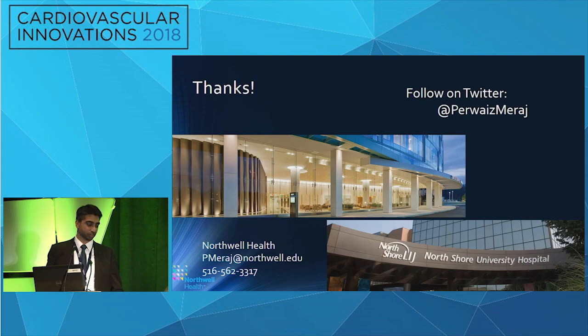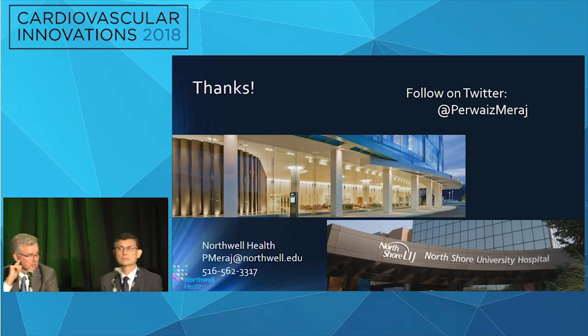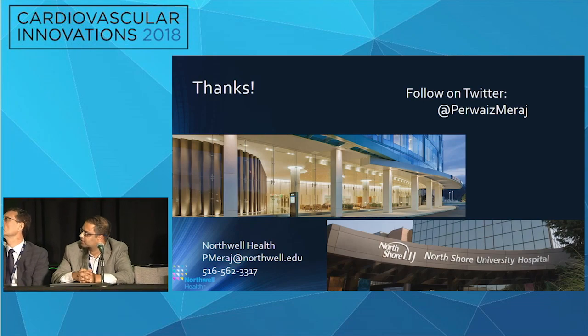In that explosion, you're attempting to fissure whatever's back there. It's very effective for fibrous plaque behind stents. It's less effective for calcified plaque, but it is something that we have been doing. So my pacemaker use has really dropped considerably. Do you use pacemakers in most cases?